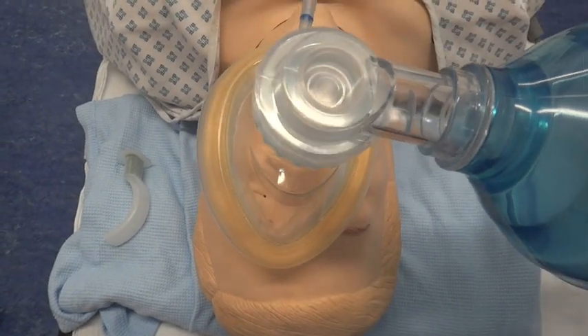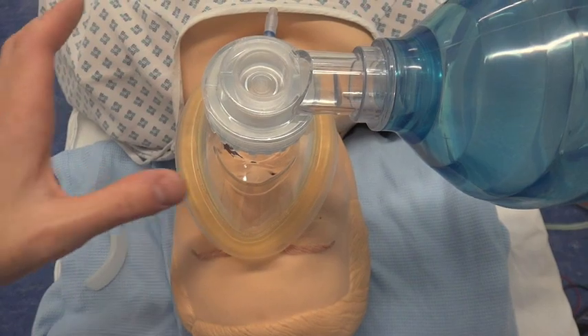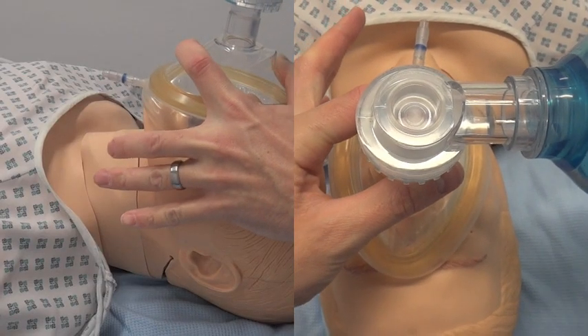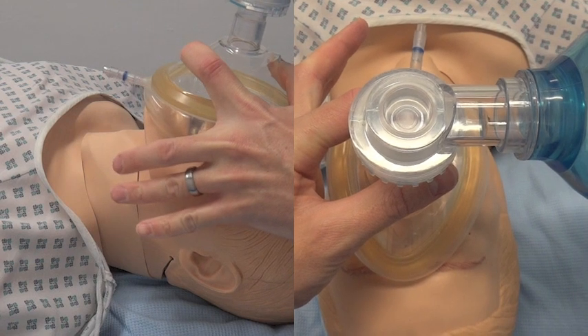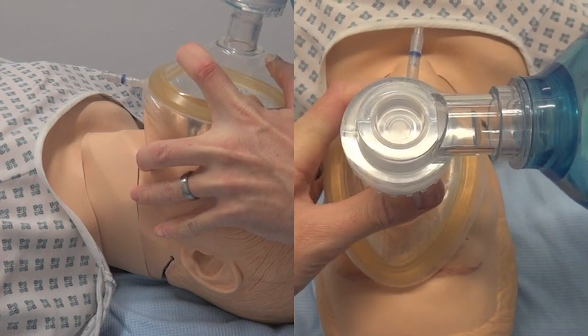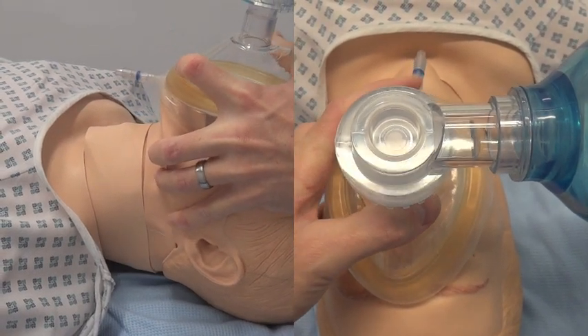Then place the mask firmly over the patient's mouth and nose. Using your thumb and forefinger, apply downward pressure on the mask onto the patient's face, and use your middle, ring, and little finger of the same hand placed under the angle of the patient's jaw, lifting the jaw into the mask.